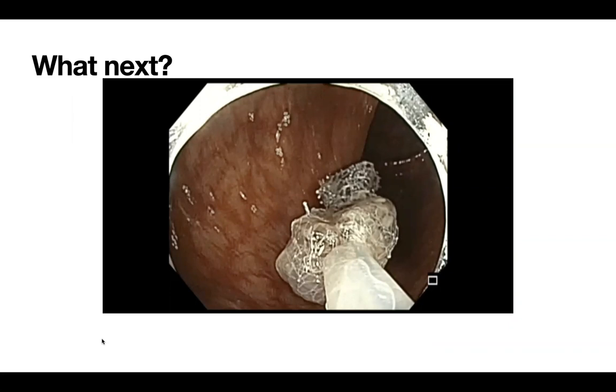I also want to make it a point that what I do is probably not part of a routine practice. Sometimes you see patients with serrated polyposis where you end up cutting a bunch of polyps. And in those cases, if I'm using an adult scope and I try to suction it and I cannot suction the polyp, and then I have a bunch more polyps to cut, right?